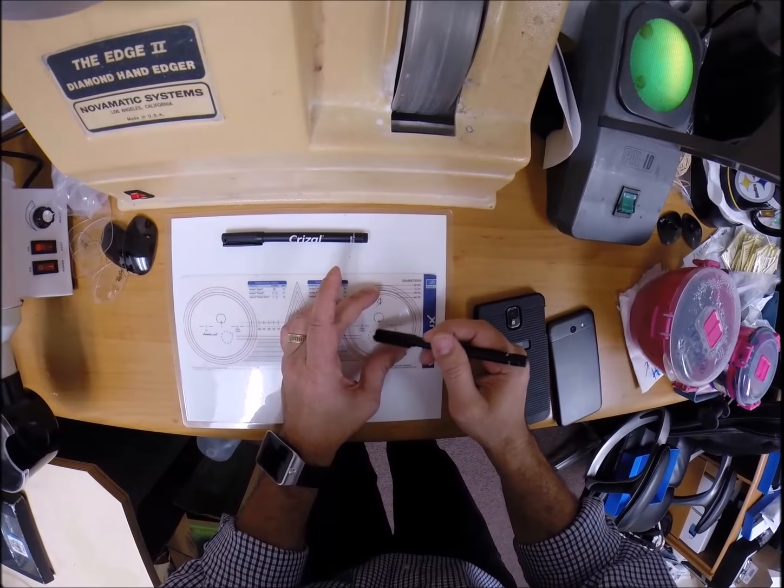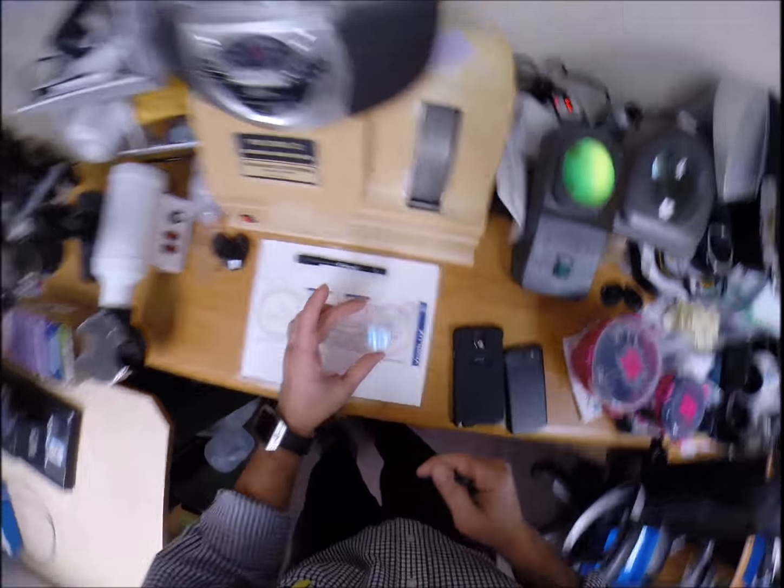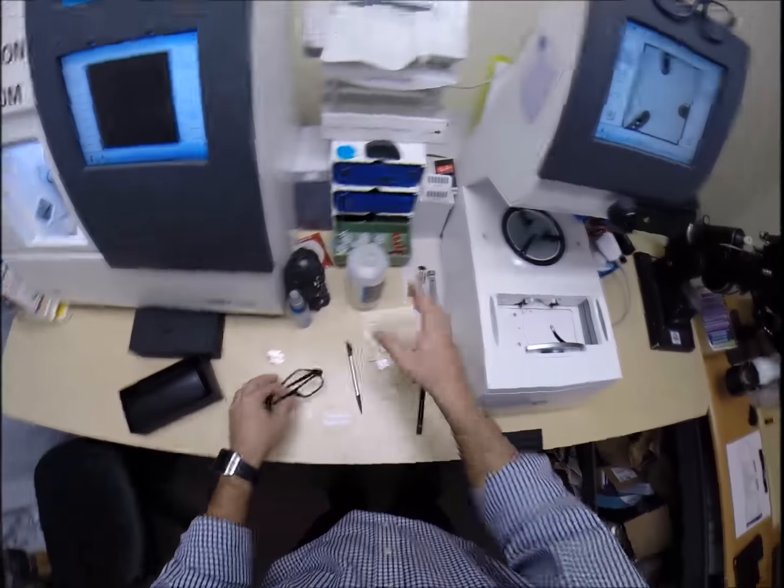It comes with a little plastic sleeve that you sent to me after it was shipped to you from Italy, because all Persols are made in Italy. Really nice frame. I love that little hinge on there, that silver accent piece.